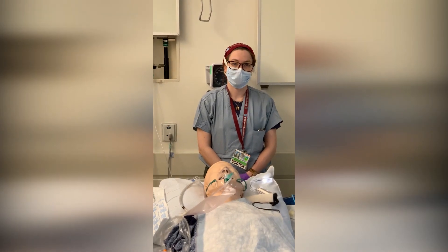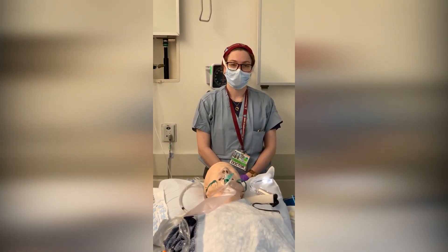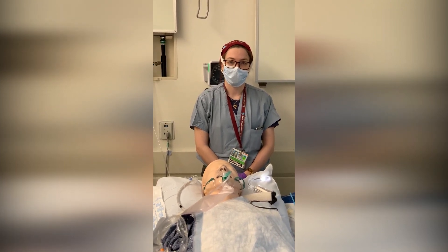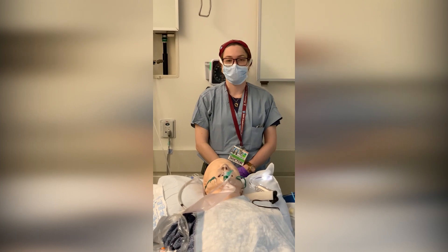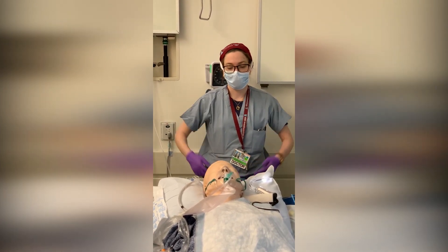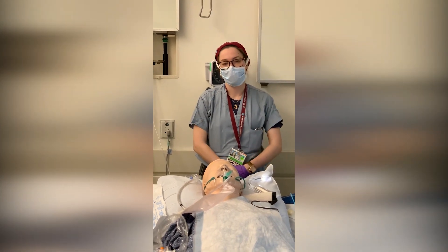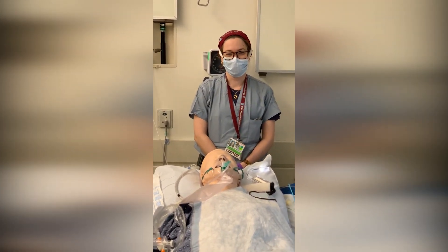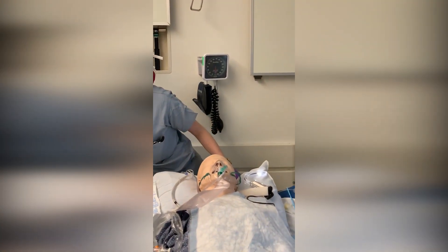This is a simulation of an ICU intubation of a COVID-positive patient. The three people in the room would be an attending anesthesiologist, a respiratory therapist, and an ICU nurse. Everyone would be in strict isolation PPE. For the purposes of demonstration, we will not be wearing the PPE.